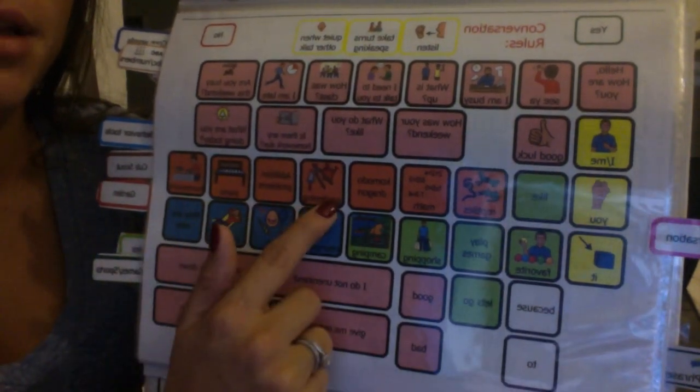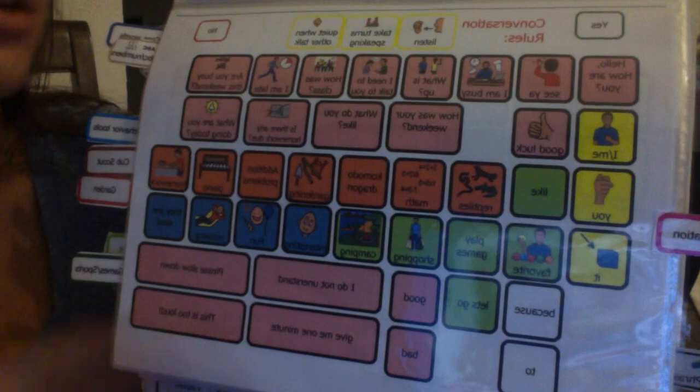Here for the conversation board, I created some quick phrases that he could say to initiate a conversation, but also ways he could reply. So for example, he could say, hey, what's up? If he sees his friend in the hallway, or when he enters the classroom, or let's say, how was class? And his friend says, the class is good. I have a test coming up. He could say, oh, good luck. If his friend asks him, what do you like? He could say, I like reptiles.